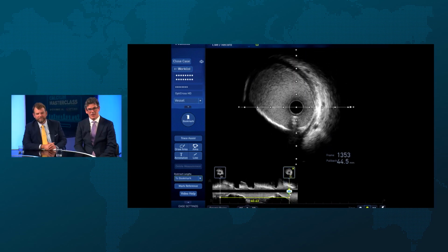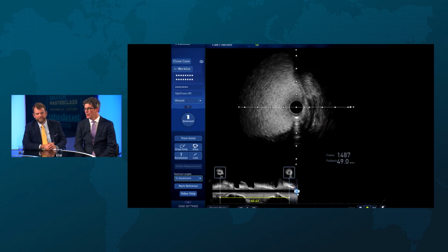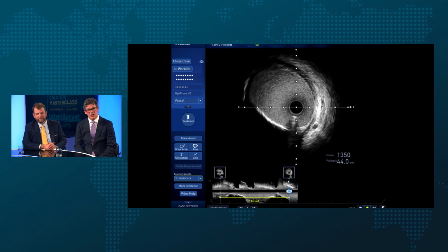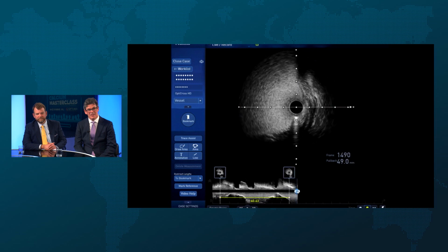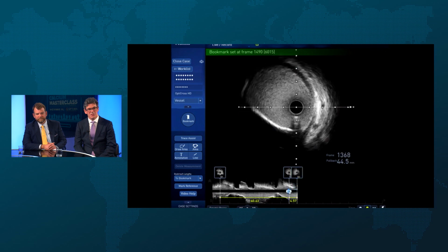So you're going to have the proximal edge of the stent over the circ, aren't you? So with more struts over the circ. And what's the gap between that and the ostium? It looks like there's still 4 millimeters there. Maybe mark the ostium of the circ. Okay, yeah. Well, you move the distal end in a bit.